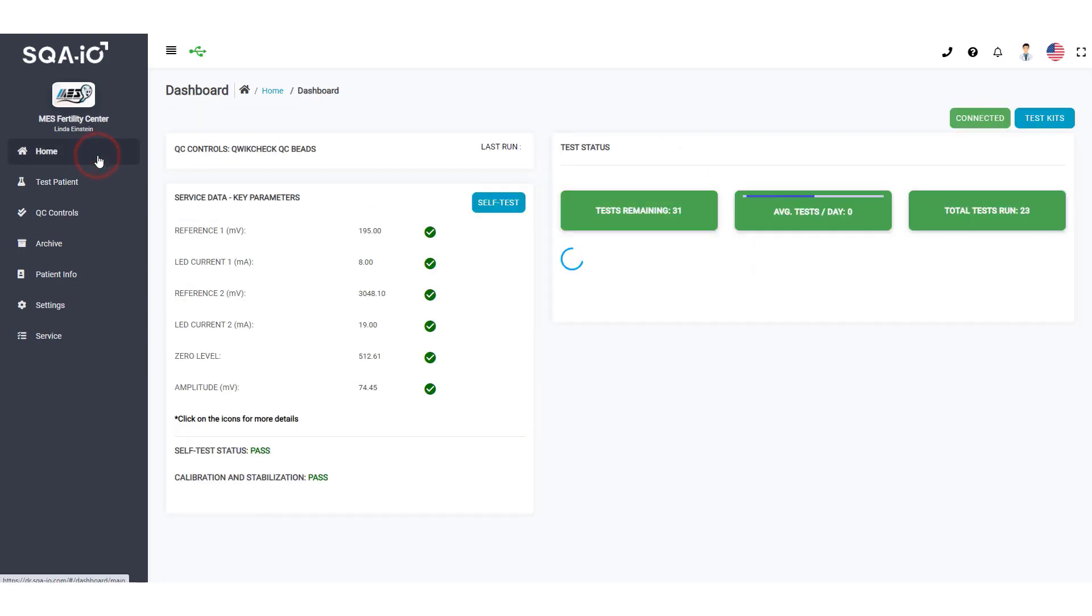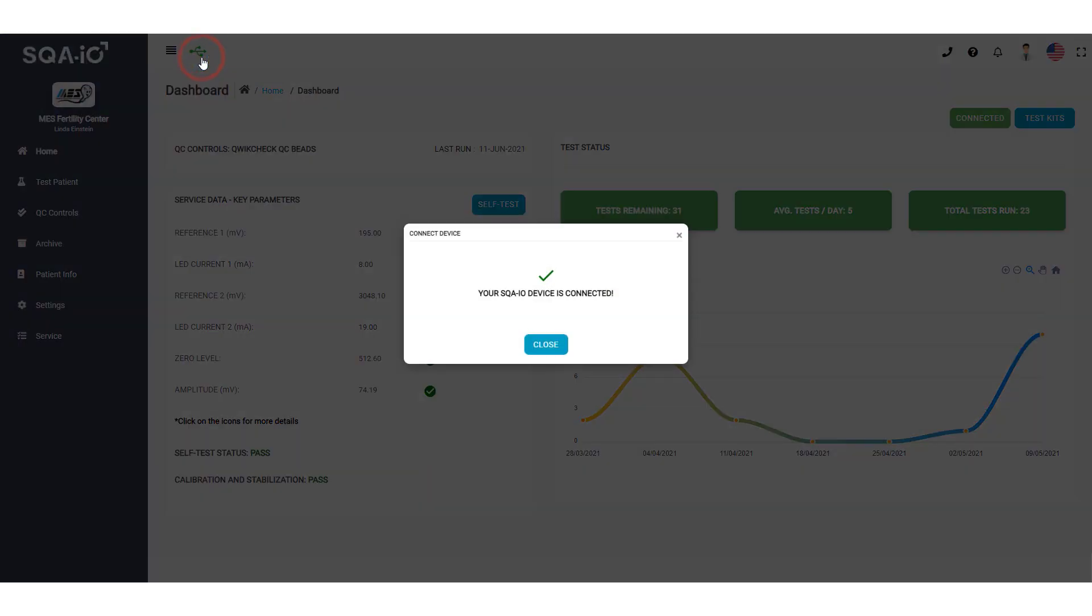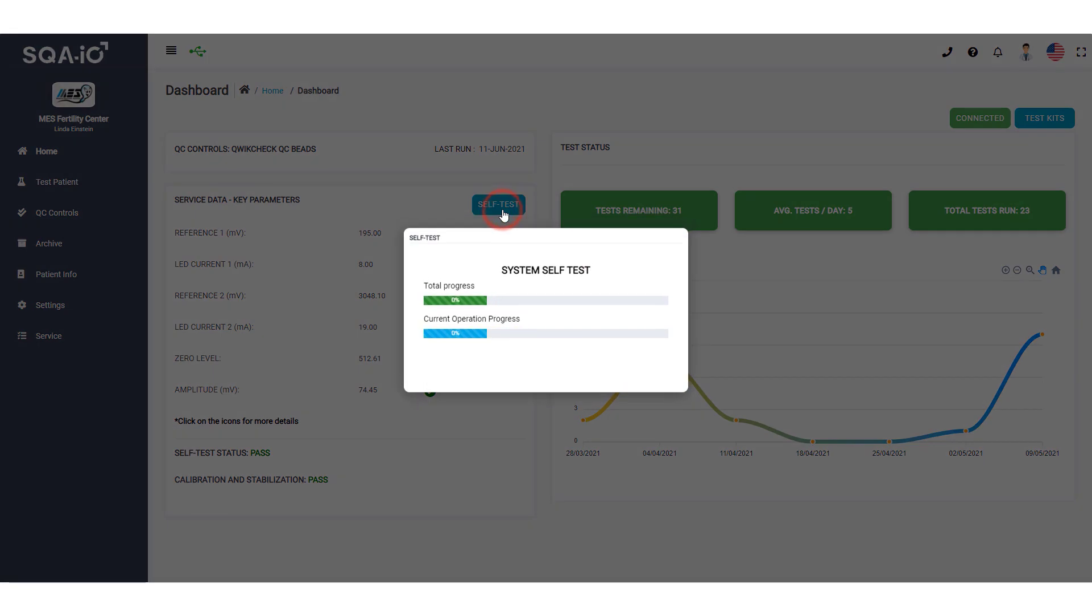Click on this USB icon to view your SQA-IO connection status. If the SQA-IO is not connected or an icon is red, click the Self Test button and wait a few seconds.